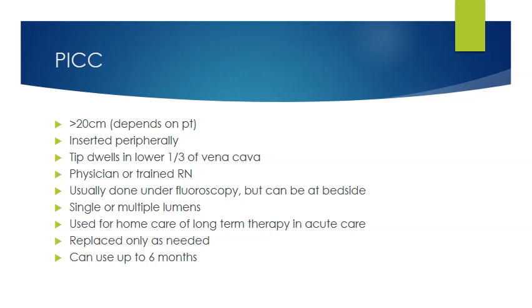Again, x-ray verification has to be used. Single or multiple lumens. Usually a PICC has 1 or 2. It usually doesn't have more than that. And we usually use PICCs for home care, long-term IV antibiotic therapy if the patient has to go home for that, so that they don't have to stay in the hospital.